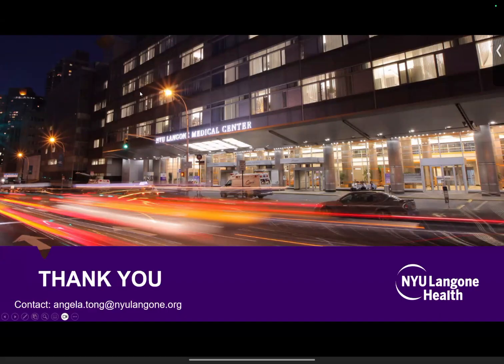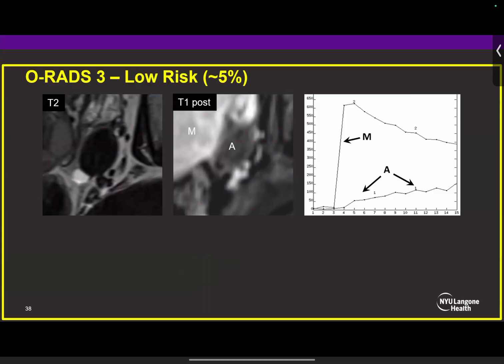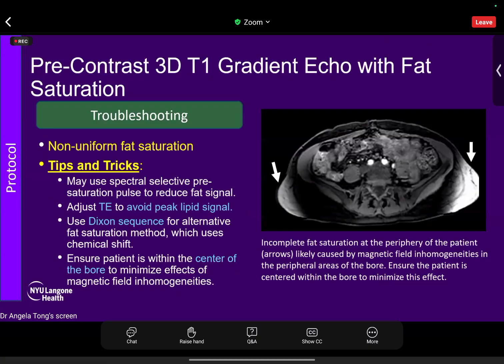Thanks a lot, Angela, for delineating, especially the protocol, which was very beautifully explained. There are a few questions, and I think we have some time to answer them. So let's start with the questions related to the protocol, because there are a few of them. You talked of a temporal resolution of 15 seconds and the need to take it till at least 3 minutes. So then one anonymous attendee is asking, overall, how many contrast acquisitions should we take on the dynamics?